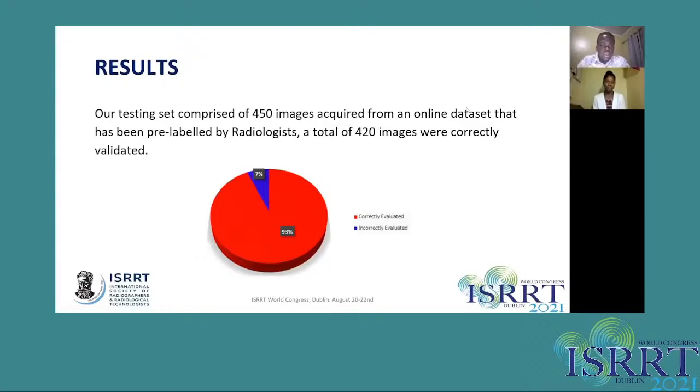Due to facing significant limitations in acquiring a large amount of radiographs from local hospitals in the current pandemic, our testing set comprised of images sourced from online databases such as Kaggle and Chest X-ray 14. Following our study design, we presented these images to be evaluated by the team of radiologists as a base of comparison, and then by our convolutional neural network.